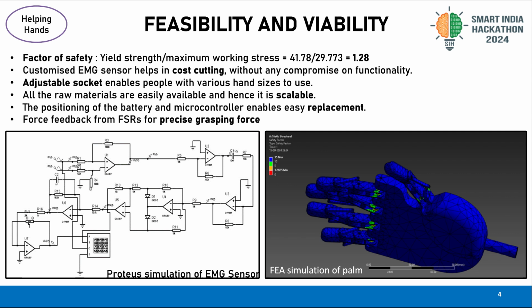Adding on to the placement of electrodes, instead of placing the electrodes uniformly around the circumference of the forearm, we will be placing the electrodes on 6 targeted muscle groups which play distinct roles in hand movements. Also, this targeted sensor positioning allows us to reduce the physiological noises and other signals from interfering. To make the arm cost effective and to reduce the number of electrodes, and for various other reasons, we decided to modify and replicate the EMG sensor. This enables us to reduce the number of electrodes from 18 to 13 and also provides us ways to work with the targeted muscle and the output signal.